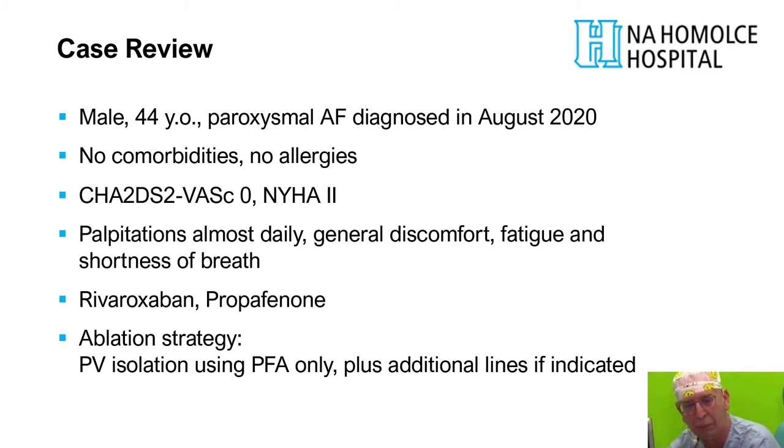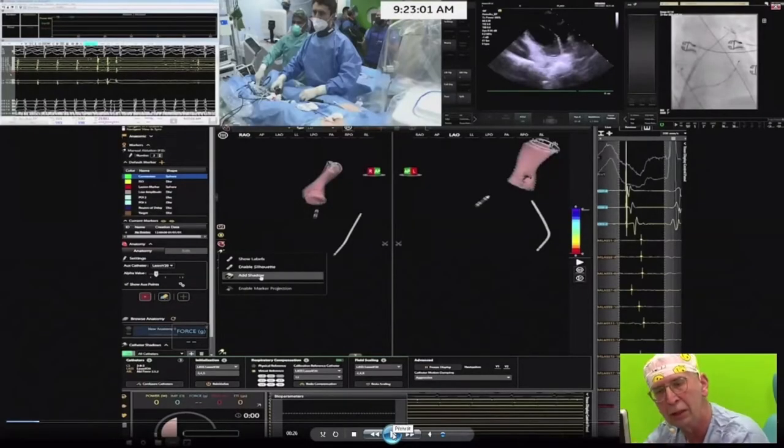The ablation strategy planned for this patient was PV isolation only, since he was originally paroxysmal, though additional ablation lines were permitted if indicated. The procedure timing is preserved in real time; fast sequences are sped up approximately 20 times but not cut, so the full movie is kept together.